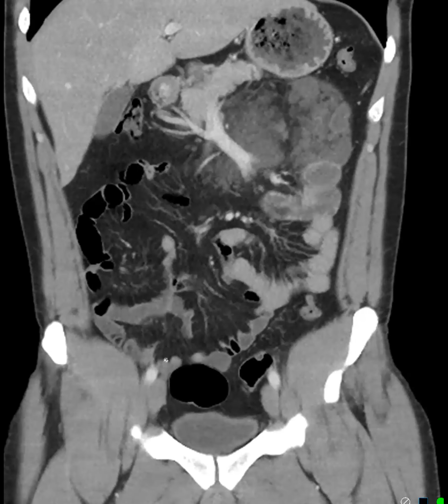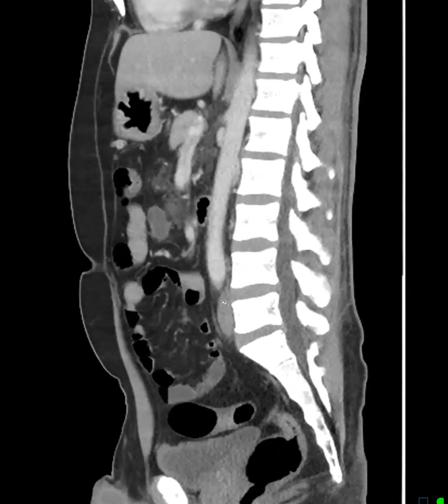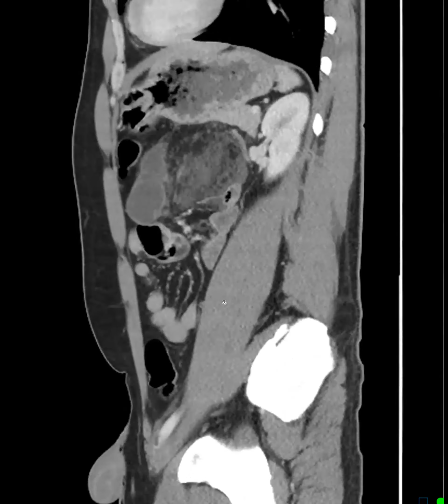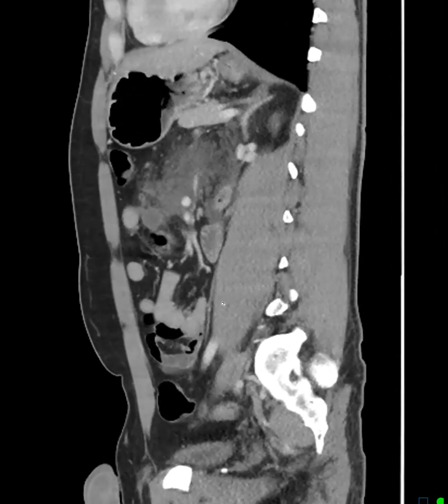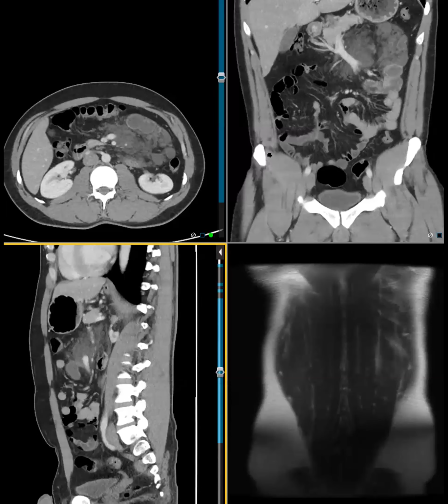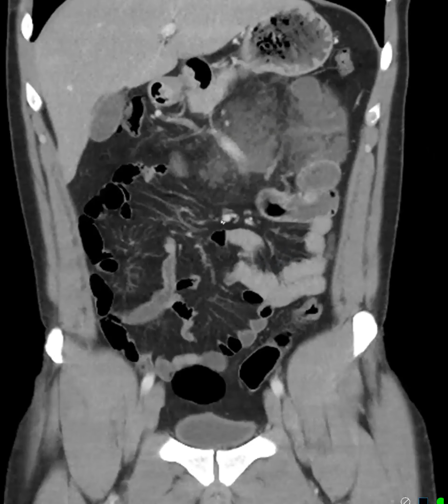or maybe even clustered, cystic. It's clustered in some kind of contained space. Sure, yeah. The non-lateral part to me looks like mesenteric lymphangiomatosis, but the lateral part almost looks like maybe it bled or is more complex.